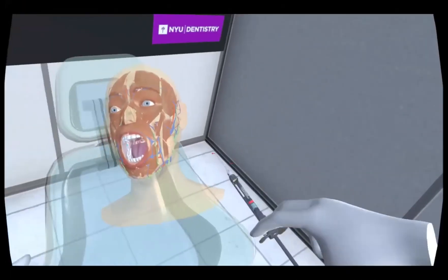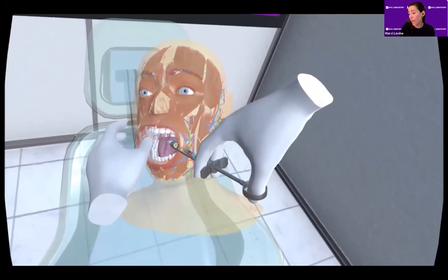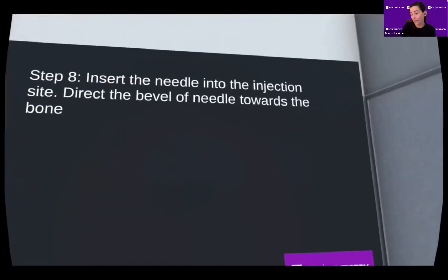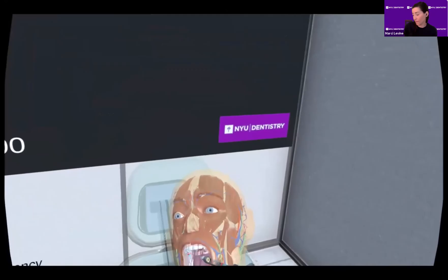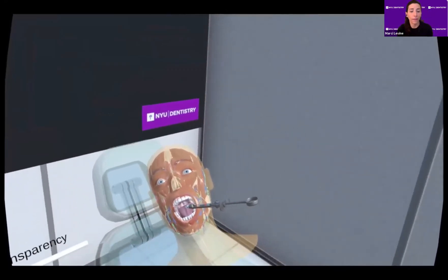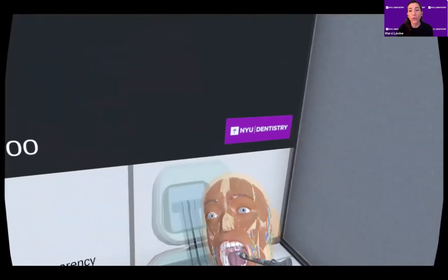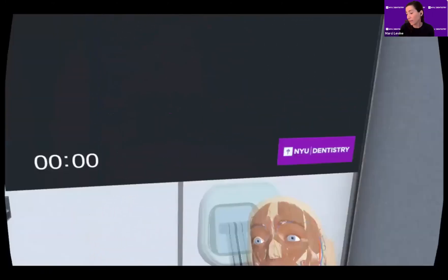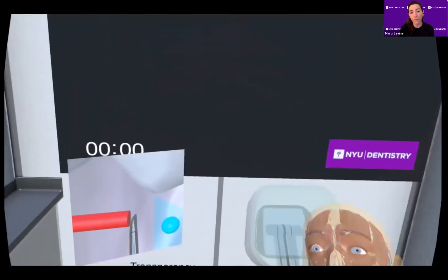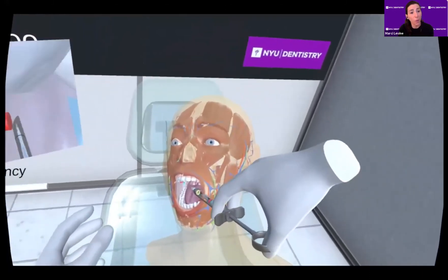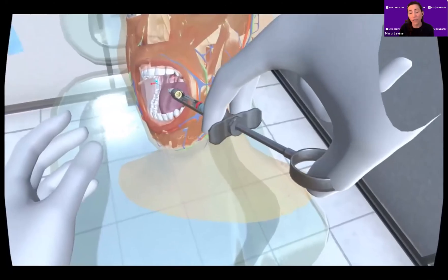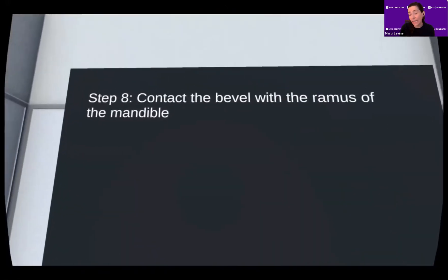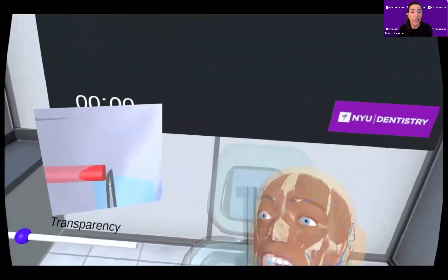Students may be asked to repeat steps multiple times to confirm correct position, and the transparency gives them a very unique view of what is happening in three dimensions. Before moving further, the student is reconfirming the instructions and making sure that the angulation and position of the needle is correct. The X button on the controller brings up a magnifying glass to zoom in on the bevel of the needle and the planned injection site. The bevel is highlighted in red, and you can see the detail of where it is in three dimensions in proximity to nearby vital structures.